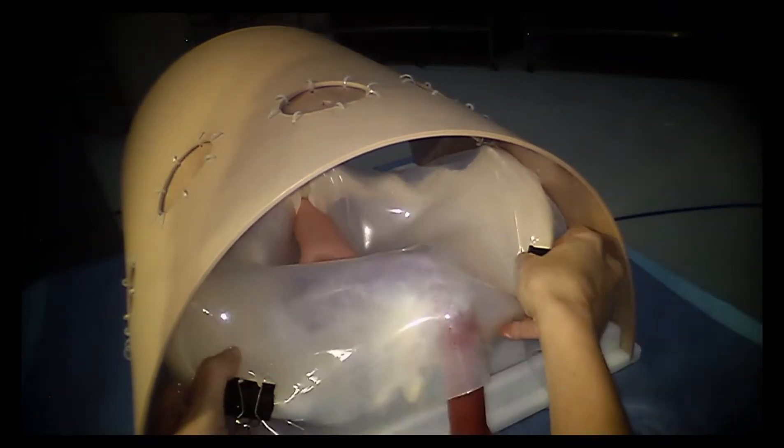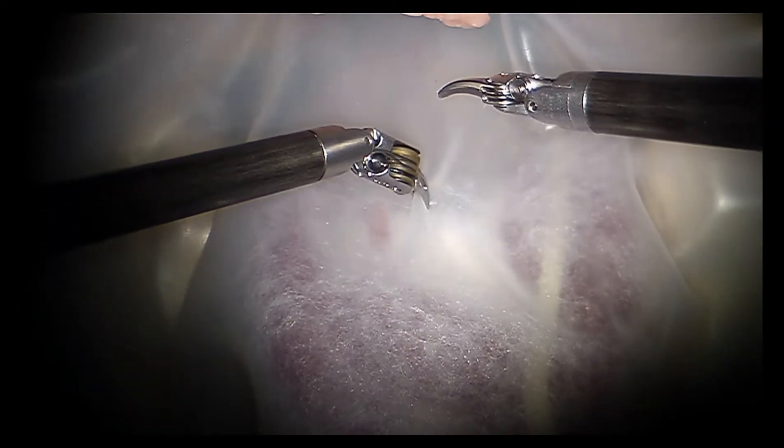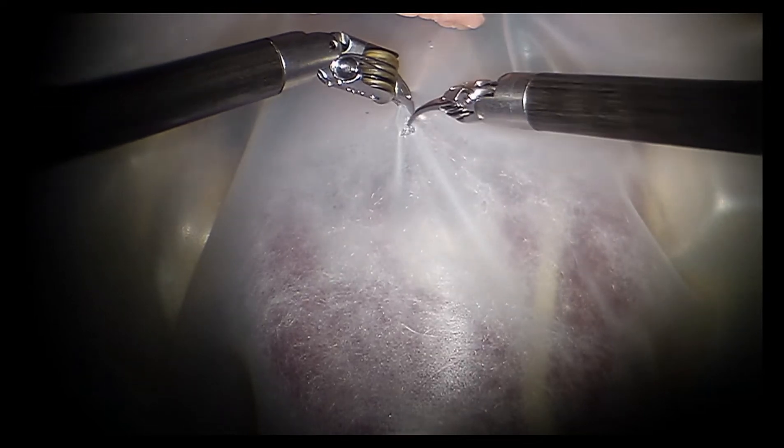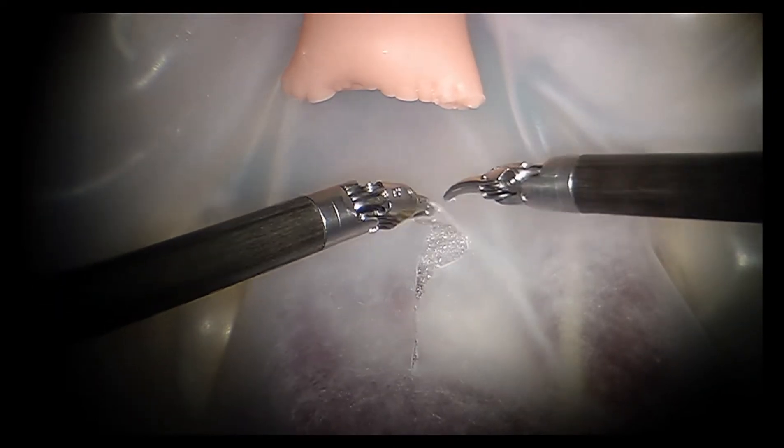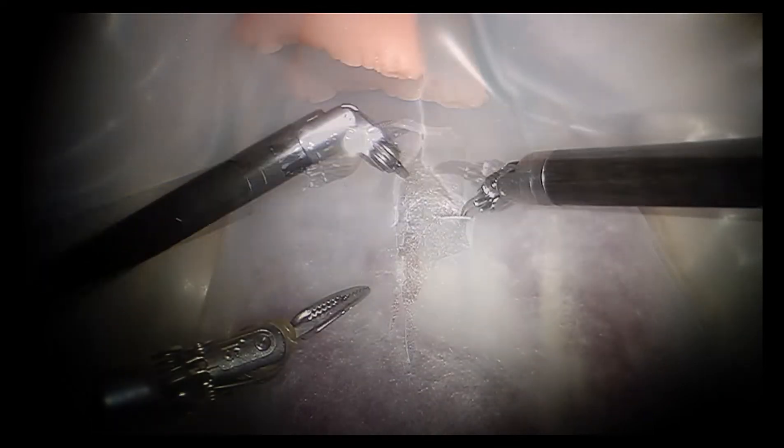The pelvic model was then placed into the robotic exercise kit. According to our hierarchical task analysis, the first subtask at the time of robotic sacrocolpopexy is survey of the pelvis. The presacral dissection begins with the visual inspection of the ureter at the bifurcation of the right common iliac artery.